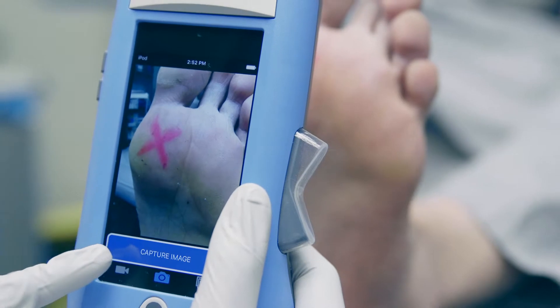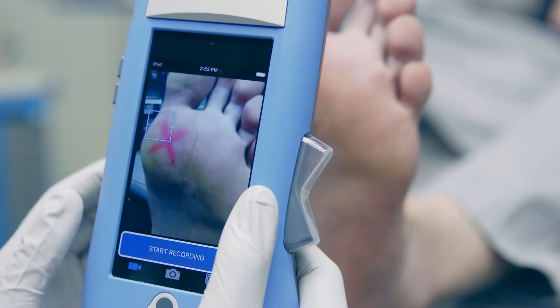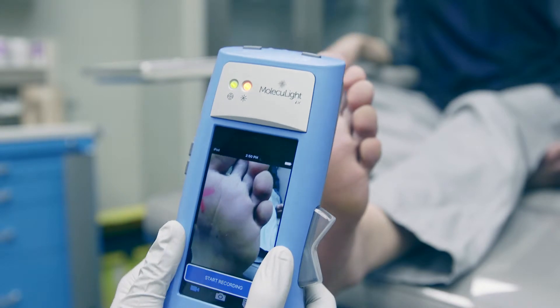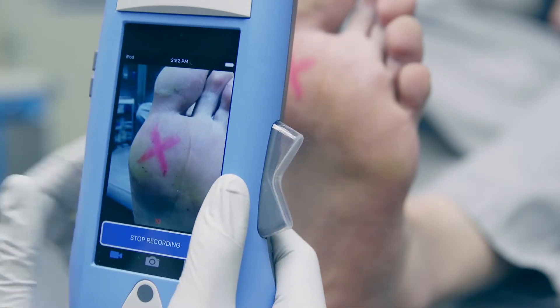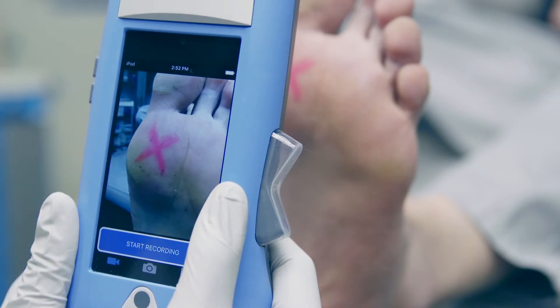Or if you'd like to take a video, press the video icon in the app. Then tap the screen to obtain focus, then press start recording. As you move the camera around the area, note the rangefinder LED and make sure it remains green in color so you know you're at the optimal distance to capture the images you need. When you're done, simply press stop recording at the bottom of the screen. It's that easy!